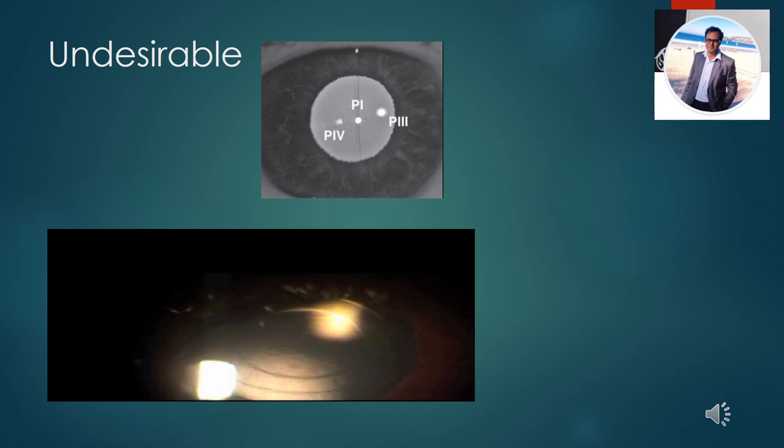So what you need to do post-operatively, when you're seeing the patient, is not just see him in the slit lamp. In a patient's meiotic pupil, you do not dilate the patient. What you'd like to observe in the meiotic pupil is the reflexes from the cornea and the reflexes from the lens, which you could see through the lens's bullseye. The bullseye is basically the absolute central part of the lens, where you do not see the steps. So you should ideally see the corneal reflex and the lens reflex all passing through the center of the bullseye, and you will understand that the patient is doing good in terms of centration then.